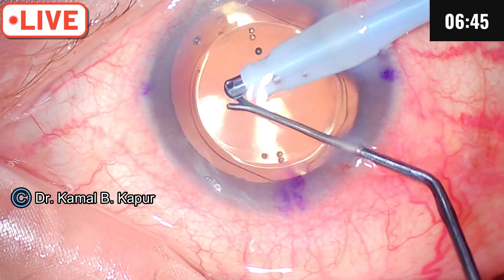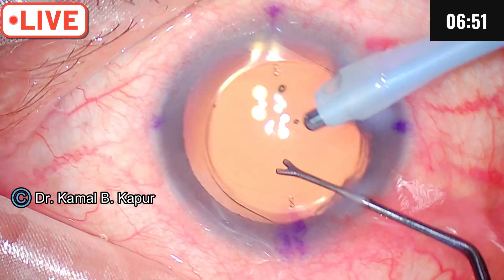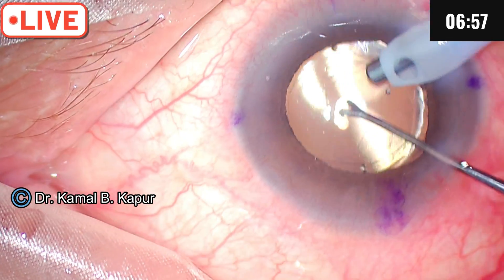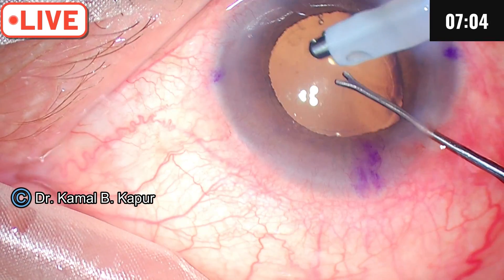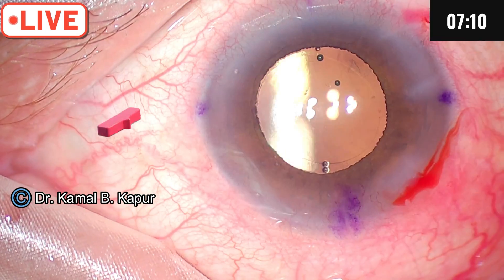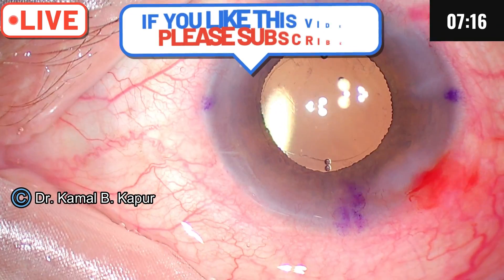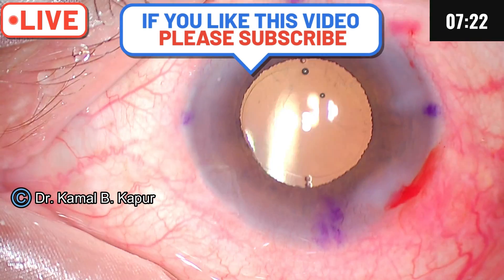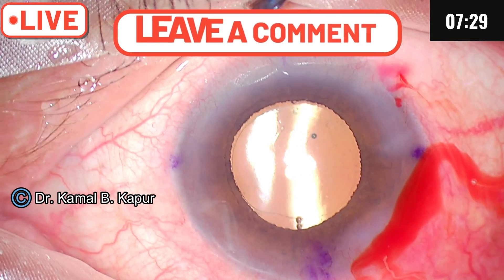Alternatively, you can use a Verion or an IntelliAxis system. This video was made for those who do not have access to such equipment; otherwise, I love the IntelliAxis on my femtosecond laser machine — it is a wonderful method where even post-operatively you can check the alignment of your IOL. Notice that I don't need to hydrate my main wound, as it all depends on wound construction. There you are — a perfectly aligned IOL. Thank you.